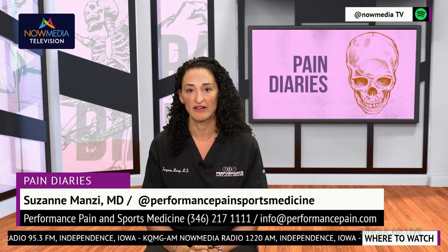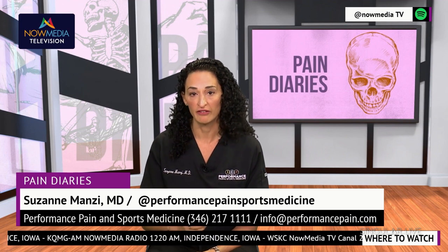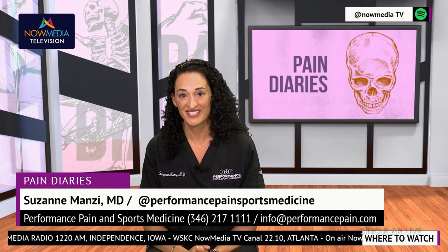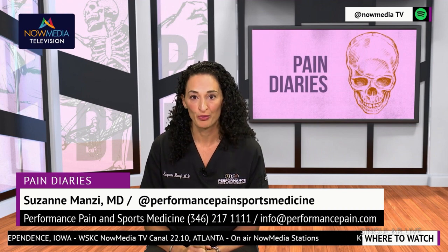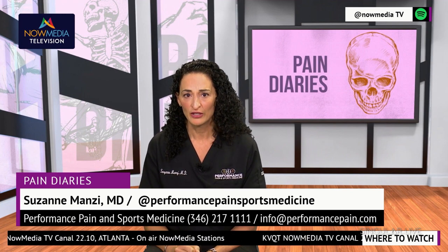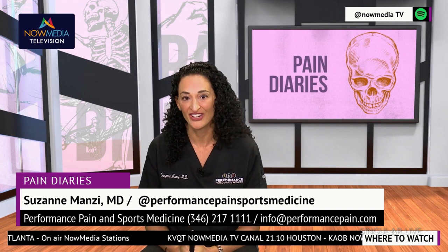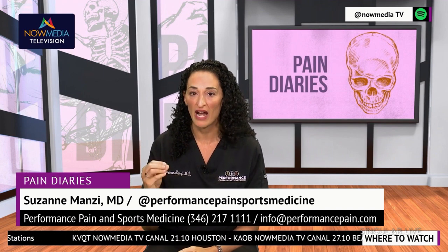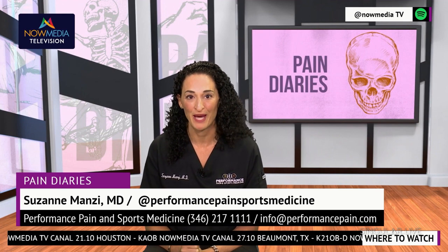Spinal cord stimulation has several benefits, including reduced pain, improved quality of life, reduced dependence on pain medication, and fewer side effects compared to traditional oral medications. As with any medical procedure, there's some risks associated with spinal cord stimulation. These can include infection, bleeding, device malfunction, allergic reaction, and sometimes even lead displacement. But we do everything in our power to prevent these types of complications from happening.